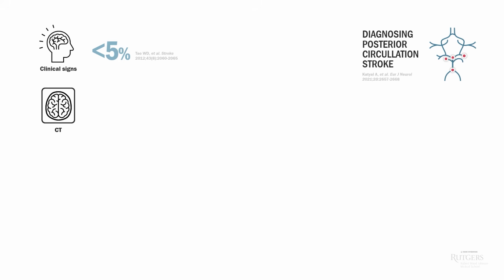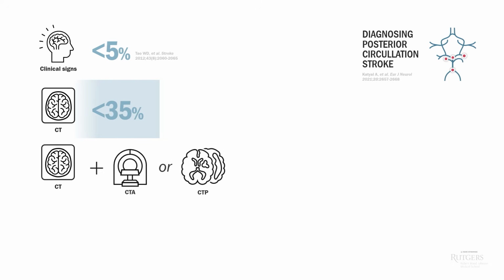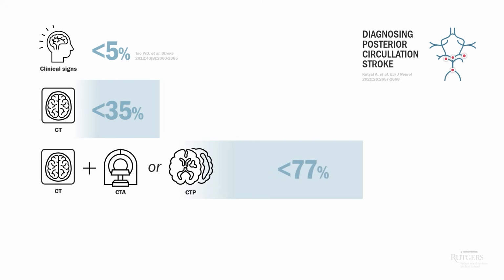Non-contrast head CT misses over 2/3 of acute posterior circulation strokes. Did you hear that, my future emergency medicine colleagues? I have very little confidence in the non-contrast head CT in these situations. Adding CTA roughly doubles the sensitivity. Incidentally, the sensitivity is similar to relying on CT perfusion alone, but that's not the standard practice. Also, you have to be careful of those base of the skull artifacts on CTP.